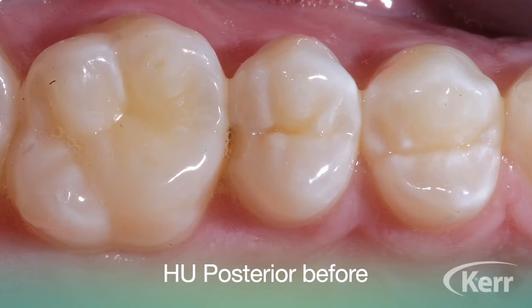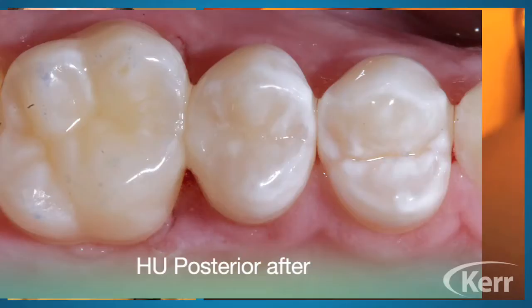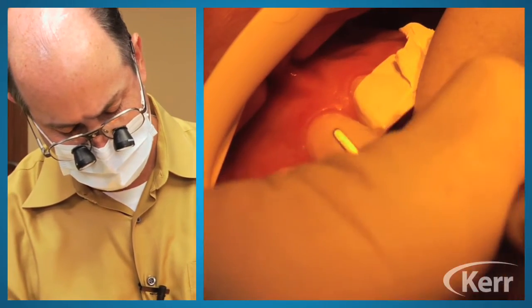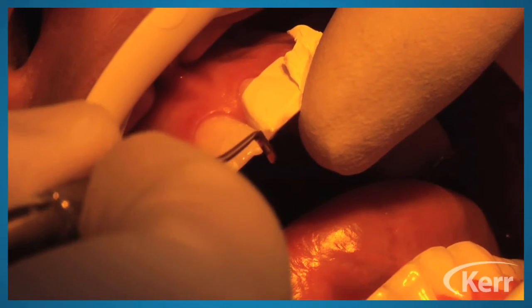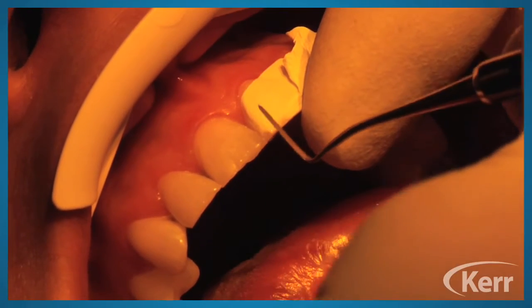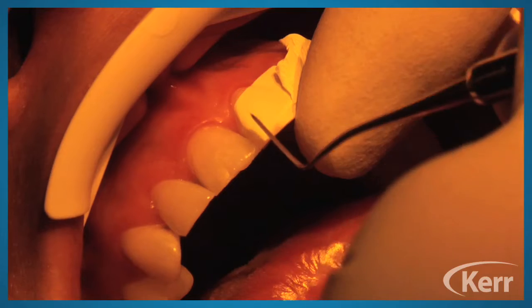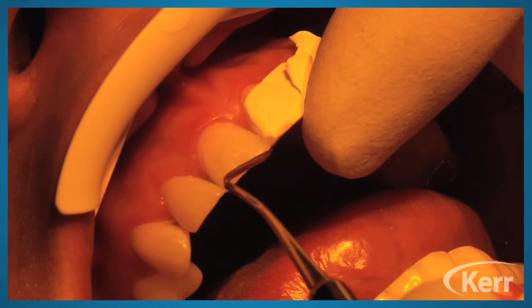So you can see that it's gone right where I wanted to put it. I'm extending a little bit off the edge, and it's just staying right there. So really nice quality, the way it handles and sculpts. And I'm going to leave just a little bit of room for a little bit of translucent, even though it's not that far off. I almost could get away without even putting any translucent down on this, to be really honest with you, but I want to make sure she has very translucent lining, those transition zones on her teeth, and I want to make sure I hit that. But you can see how I lightly touch it, and it goes right where I want it and stays there.